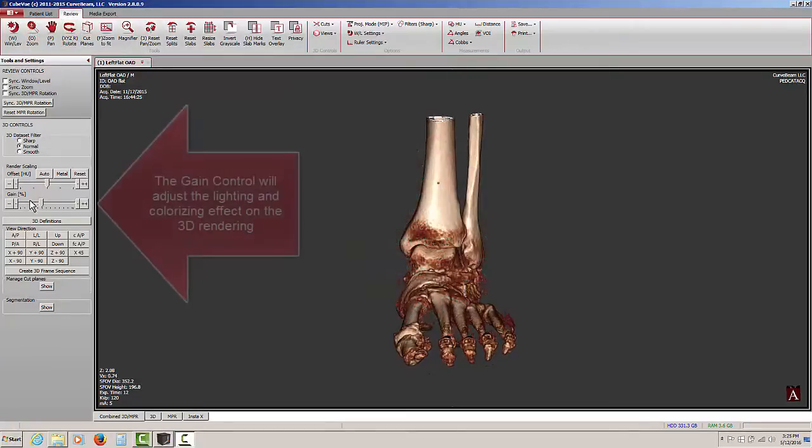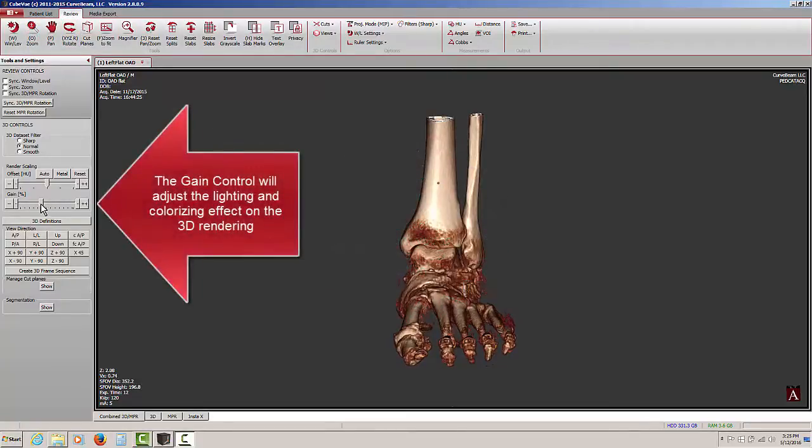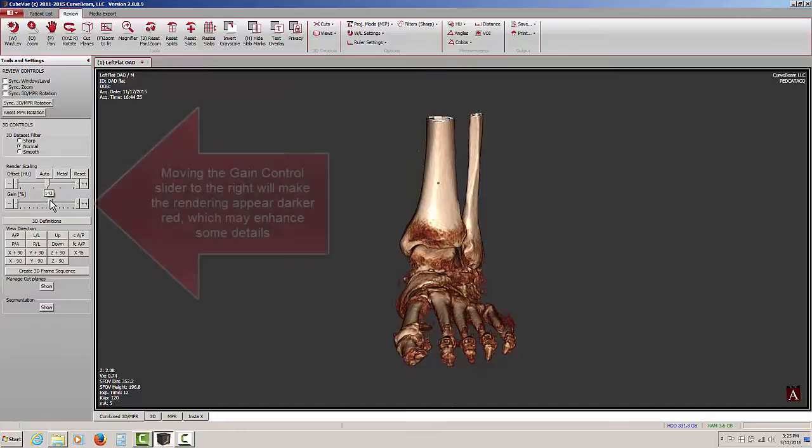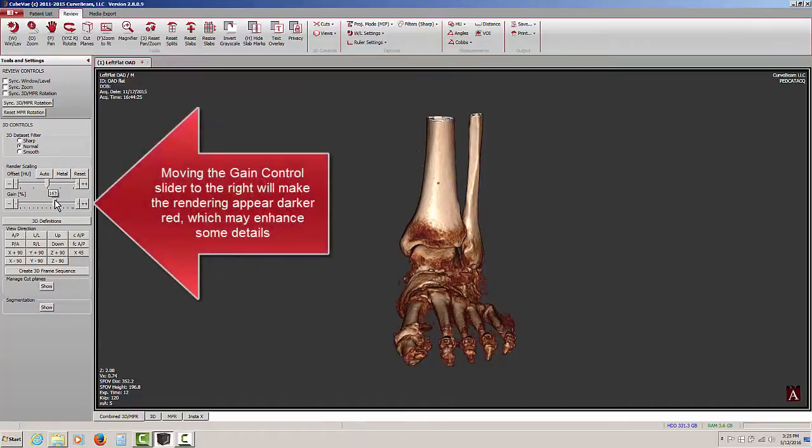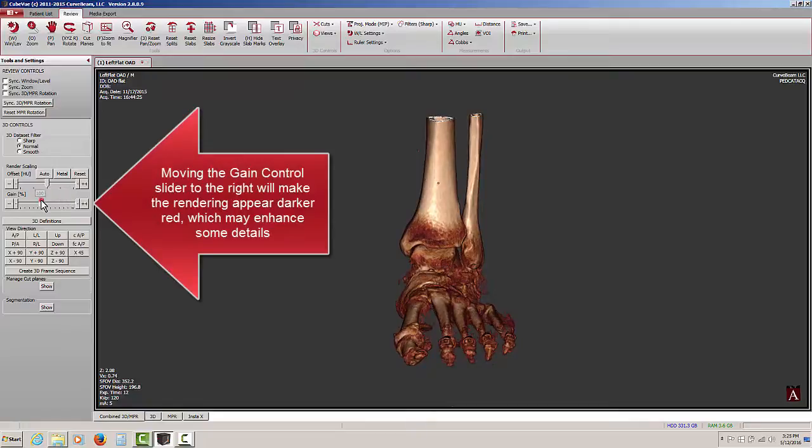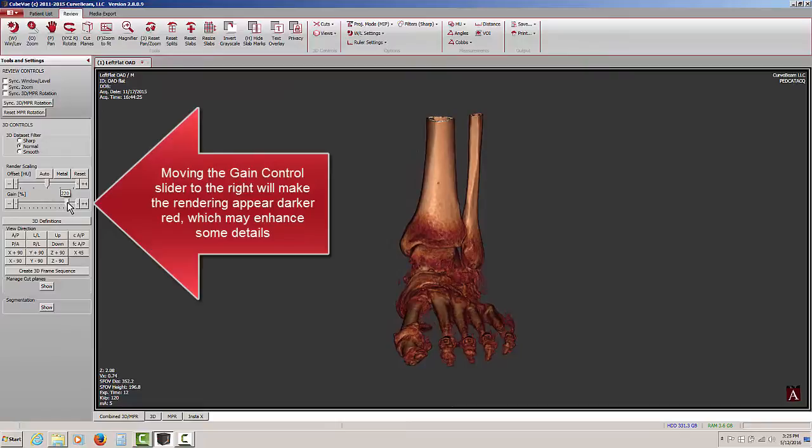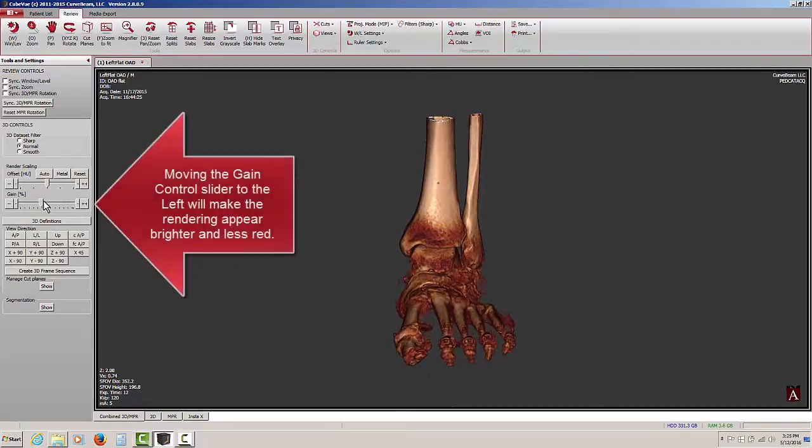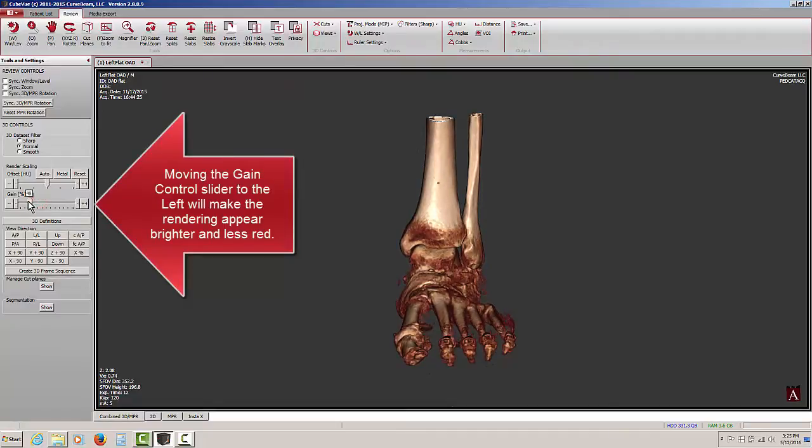Let's take a look at the gain control now. The primary purpose of the gain control, whether using the slider or the buttons, is to adjust the lighting effect and the colorizing effect. As I slowly bring the slider to the right, notice that the bones in the 3D rendering appear to be developing a darker red color, and the lighting effect is also slightly different. I can go in the opposite direction and make the bones appear whiter.